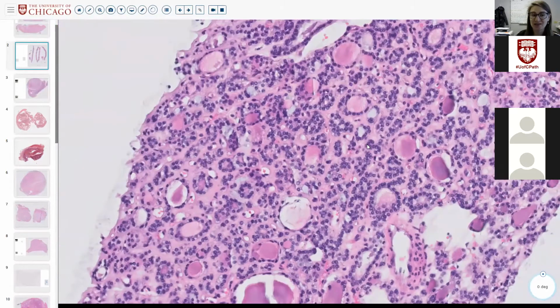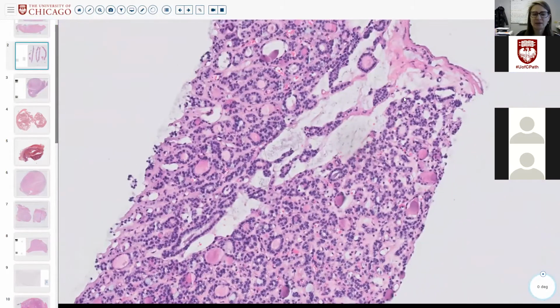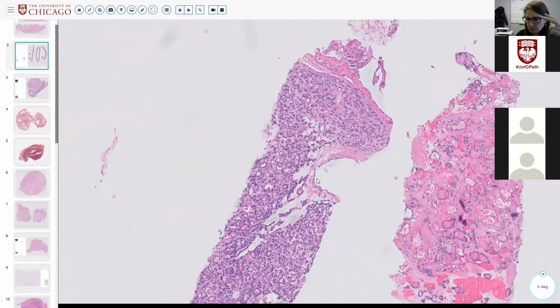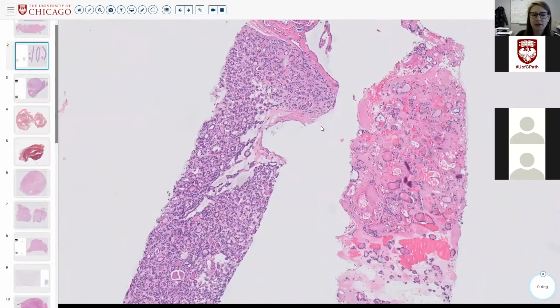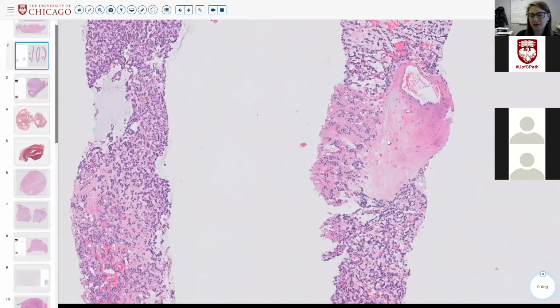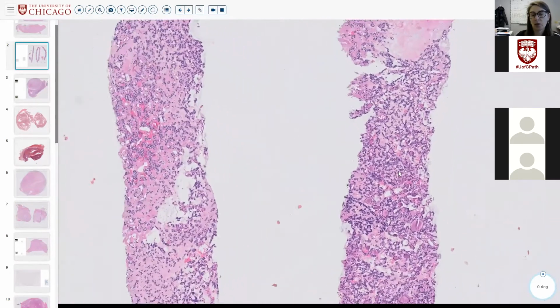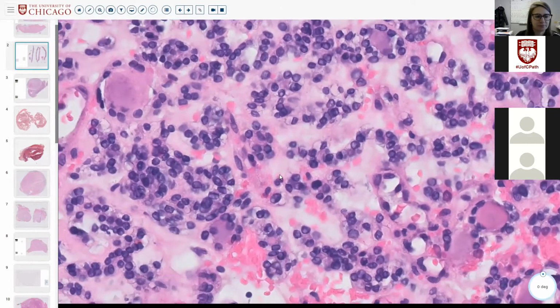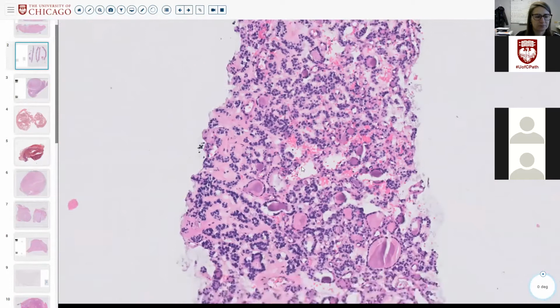This is even an H&E slide from the outside. This is our in-house H&E stain from the outside block. So even doing our stain on the tissue didn't really help. So now where are you going to give this? Does this need to come out? Is this benign, or is it malignant, or is it indeterminate? I feel like it's indeterminate.